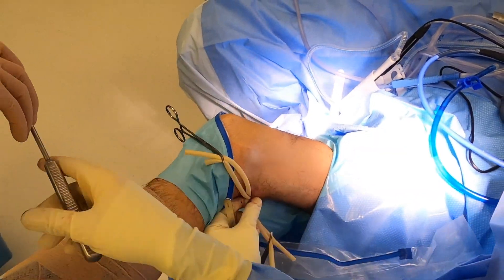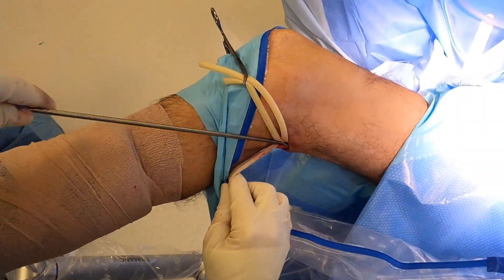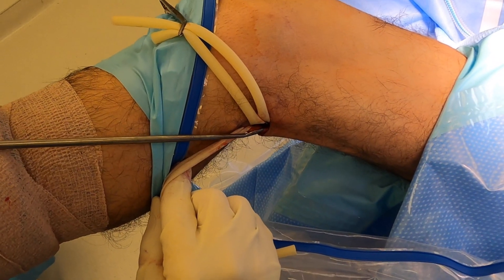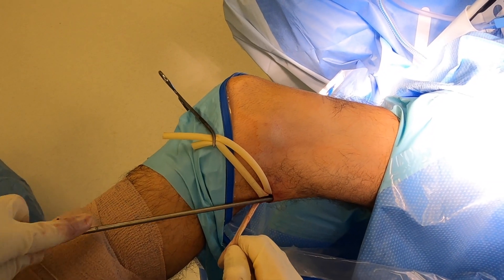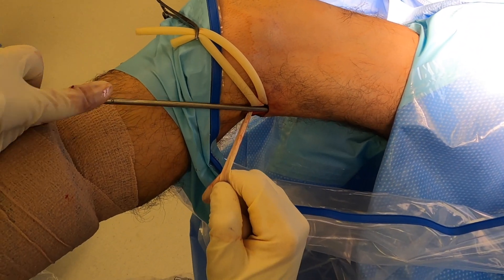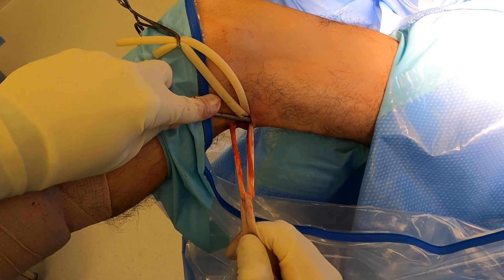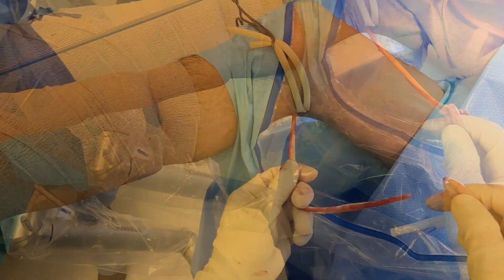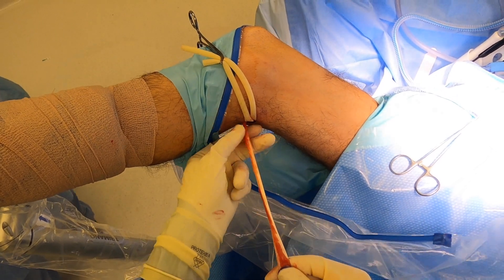I then take an open-ended tendon stripper, place it around the tendon, and run it approximately up into the thigh directed towards the ischium of the pelvis, where of course the origin of the tendon is. I'm keeping tension with my right hand on the Penrose so it doesn't bunch up as I run the stripper, and there we have a nice decent tendon that doesn't look to be amputated.